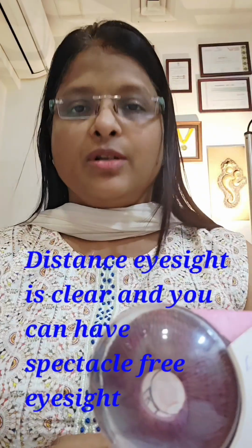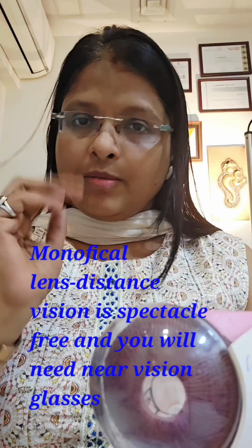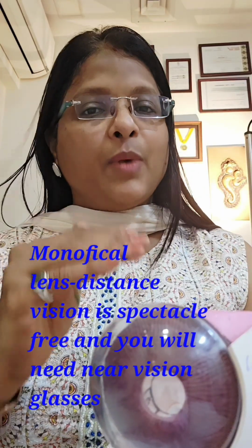It is a distance vision, distance eyesight, which is clear with the lens depending upon the lens power that you are implanting in the eye. Before implanting the lens, you have to take out the lens power. So 80% of the vision with this monofocal lens for distance is clear for you. For near things, reading, writing, mobile, computer, for these things you have to use glasses, right? So with the monofocal lens, your distance vision is clear 80%, maybe 90% depending upon the refractive error that you have and the lens power that is calculated pre-operatively. And for near, you have to use glasses, right?